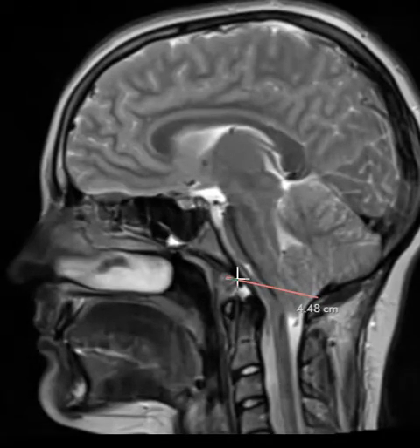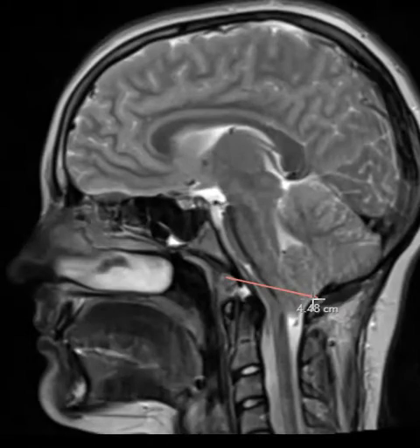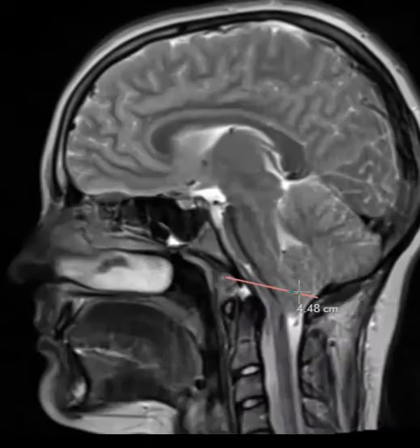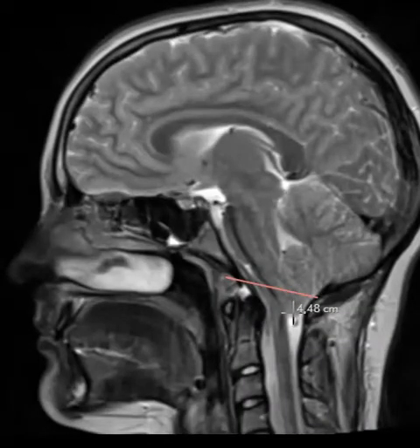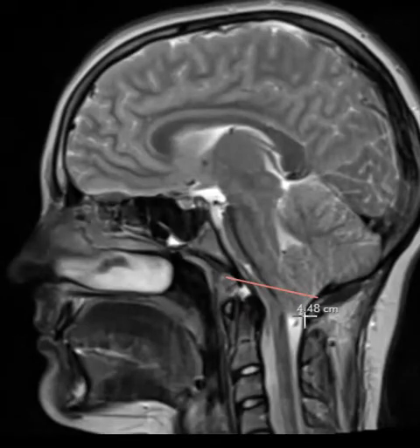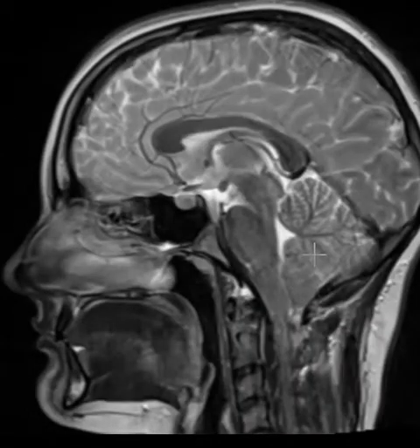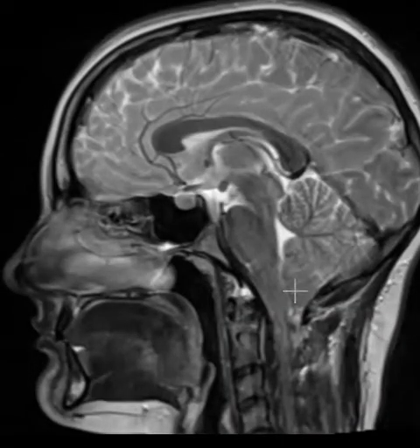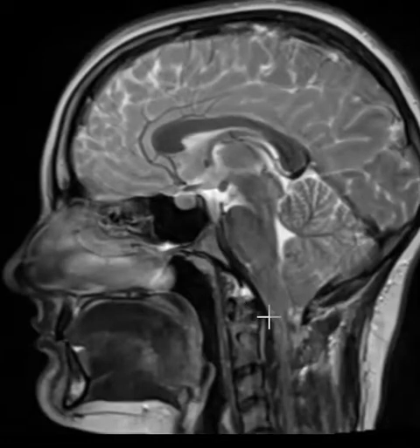And the spinal canal. So there's an area right here, and the cerebellar tonsils — the very bottom of them here — should not go down too far below this line, and hers go down too far, and the finding also produces a mass effect on this.